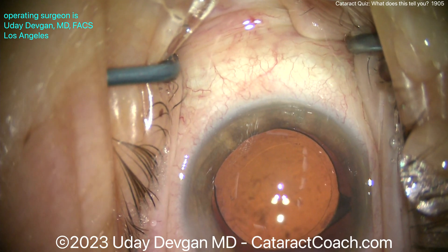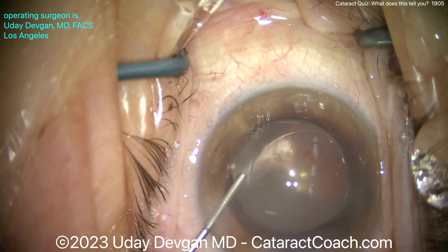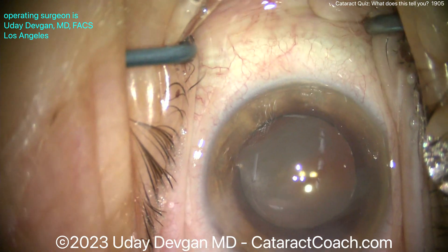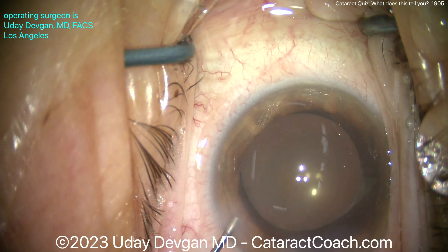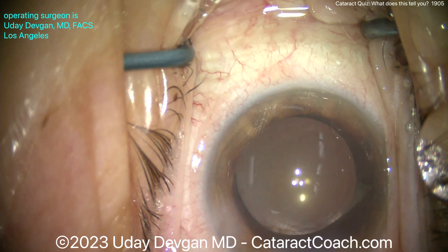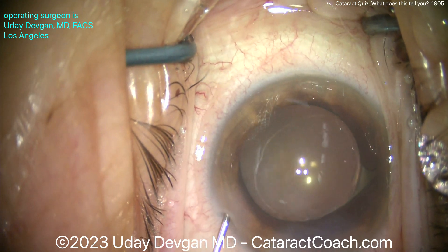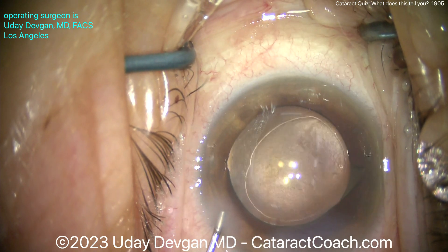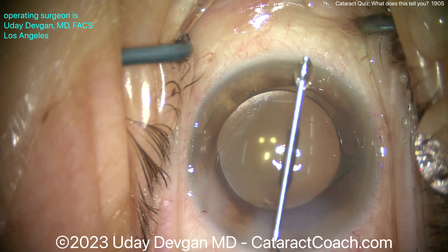Let's just make sure there's no vitreous prolapse — just in case, with all those maneuvers, some vitreous could have prolapsed. Here's some preservative-free triamcinolone — inject that in the AC. No staining, so knock on wood, we got a nice result with no vitreous prolapse. That anti-inflammatory effect is also going to be helpful in the post-op period, as this patient may have a little additional inflammation due to those tiny retained lens fragments in the anterior hyaloid face.